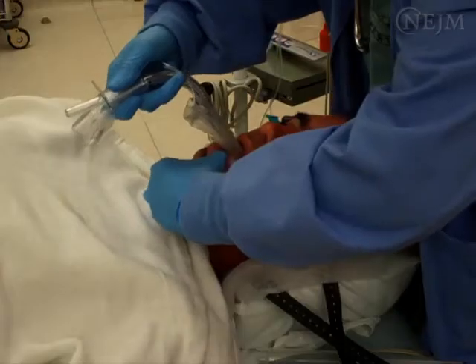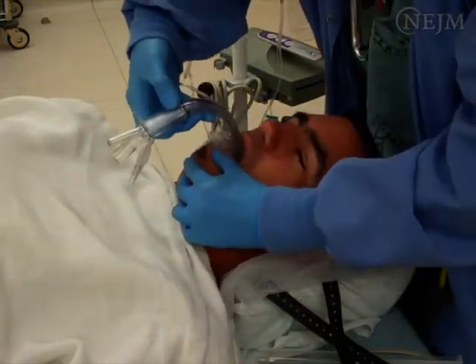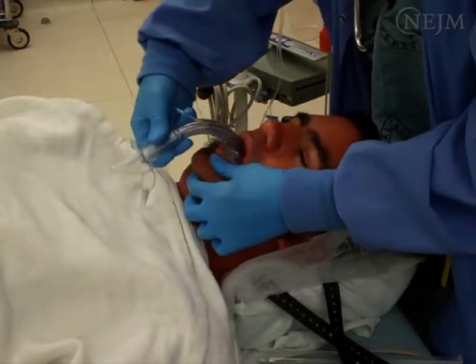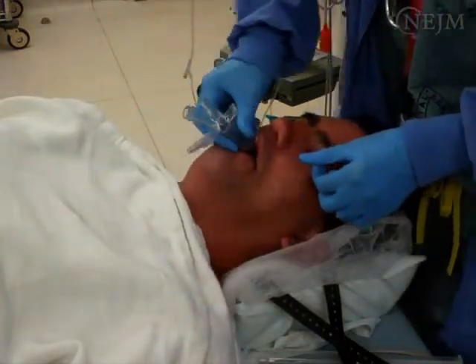As with the straight tube, guide the laryngeal mask airway above and behind the tongue by applying firm pressure along the patient's hard palate. Guide the tube behind the tongue and toward the larynx with a circular motion of the hand.